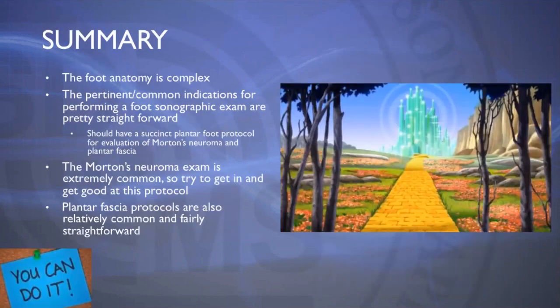So in summary, we made it to Oz, and it has been a long journey because the foot anatomy, I think, is so complex. But the pertinent common indications for performing a foot sonographic exam are pretty straightforward, mainly because the Morton's neuroma exam and the plantar fascia exams are probably going to be your more common exams that you're going to be asked to do. Because of this, you should have a succinct plantar foot protocol for evaluation of Morton's neuroma, as well as for the plantar fascia.